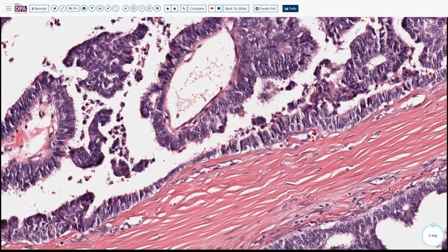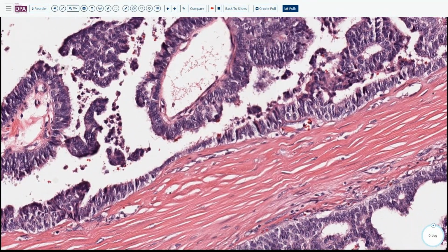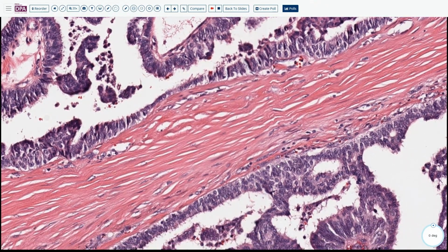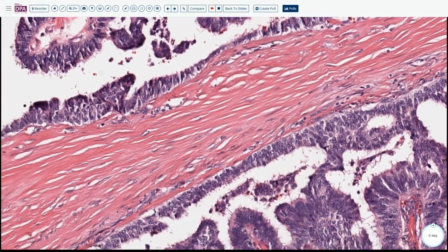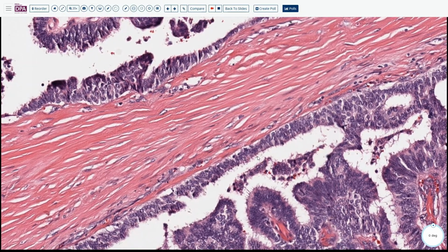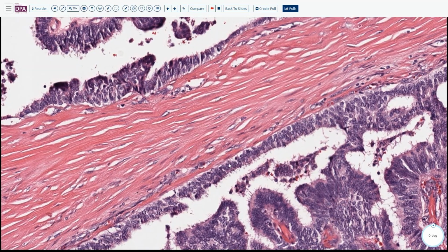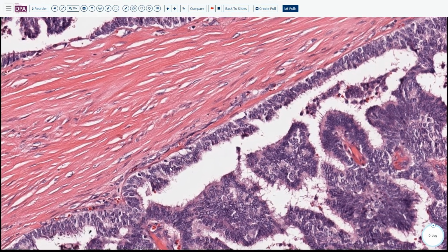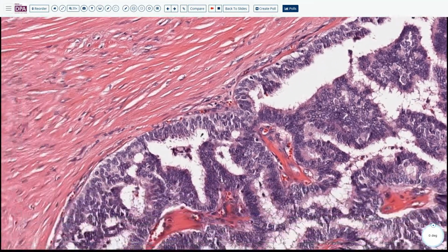So in the periphery, we can still appreciate what looks like maybe two populations. We also have what looks like some myoepithelial cells here. You can see this cell with clear cytoplasm, a little bit different from the luminal cell. And then they also have maybe a darker nucleus compared to this one, and more clear cytoplasm. But without staining, nobody can tell this for sure.